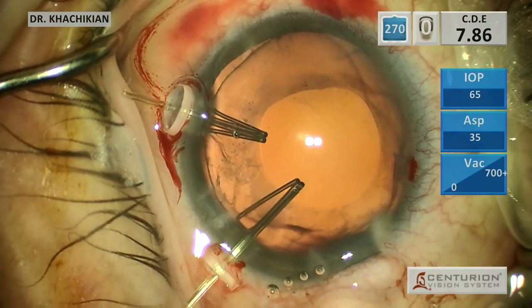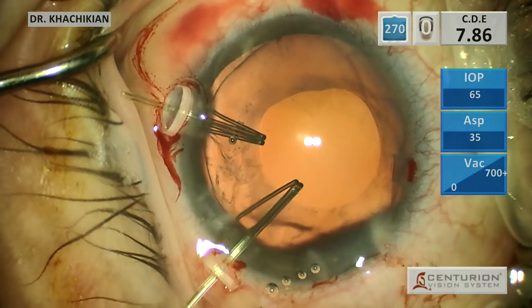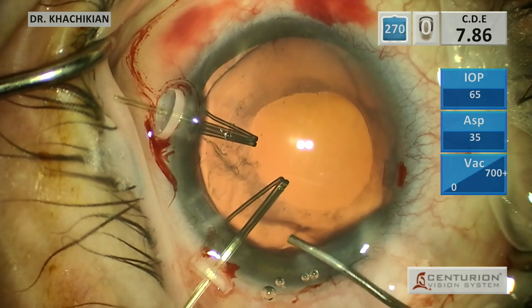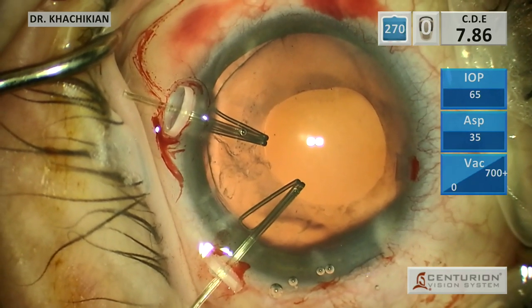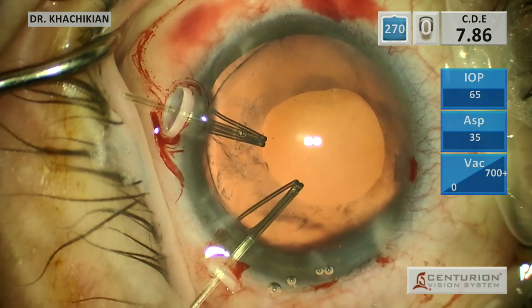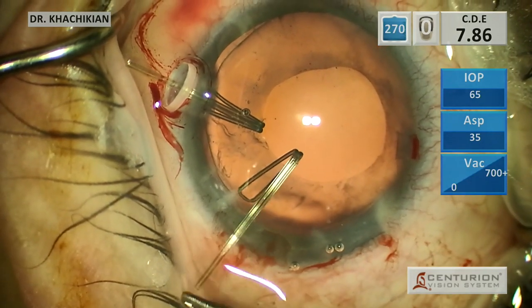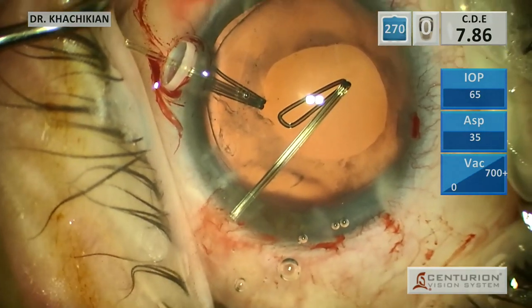We'll see what the ring does - maybe you can get away with just the capsular tension ring. But what you don't want to do is just put in a capsular tension ring, come back the next day and find that your lens is so inferiorly dislocated it's sitting in the middle of the pupil. When the patient is lying supine, it's hard to tell exactly where that IOL is going to sit. So before we put in our capsular tension ring, we want to take out our capsular hooks - because you don't want the ring to go through that lumen, that opening, and the hook there.